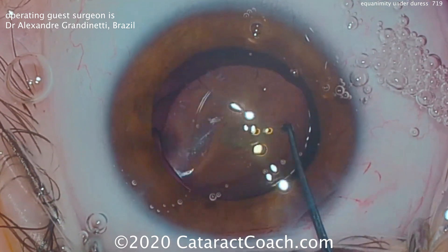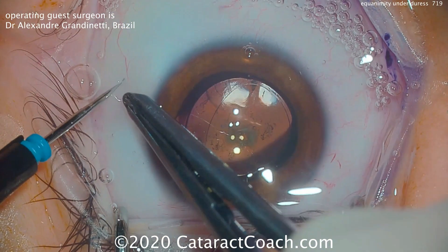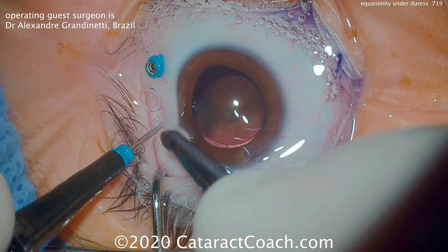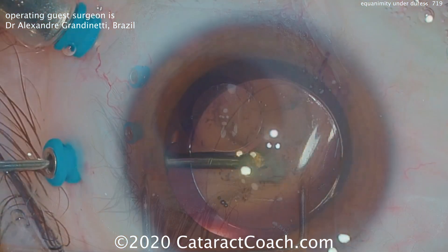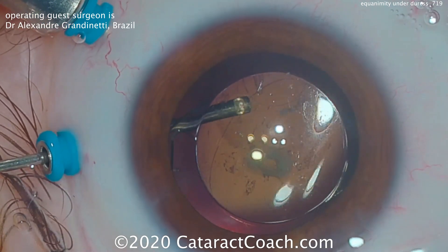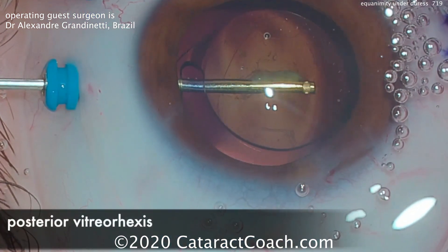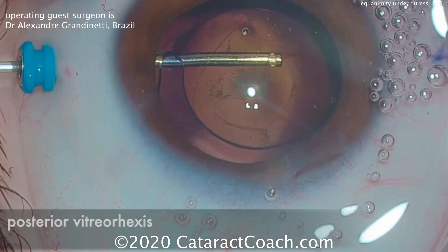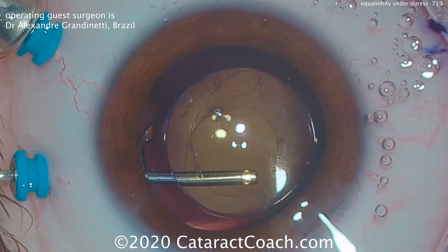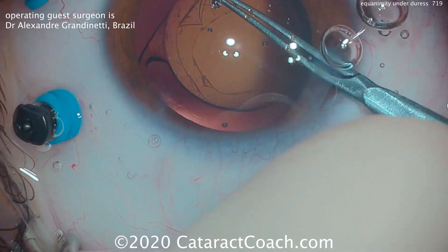Now the lens is rotated into position, and we need to clean up a little bit. There's a broken posterior capsule — you can see the opening. Pars plana trocars are being placed. I'm going to do an anterior vitrectomy to clean up the prolapsed vitreous, and then keep the IOL centered in the bag. We're able to clean up all the prolapsed vitreous and also clean out the anterior vitreous.